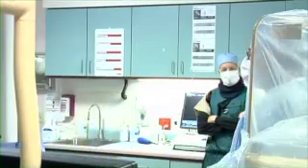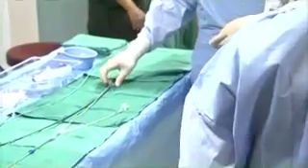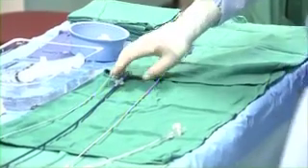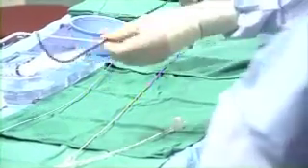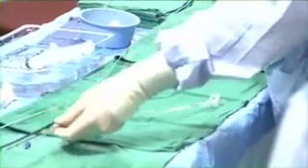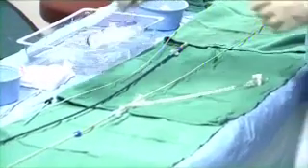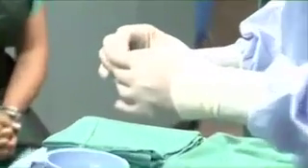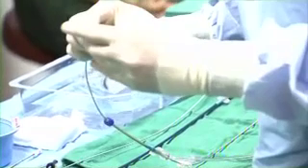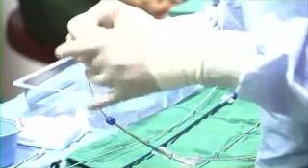Let me show you. Can you focus here for a second? Ramon, you said about 10 millimeters. How many inches is that for our viewers that don't understand millimeters? Half inch. So this is a catheter that we call the delivery sheath. Our device is going to go through this catheter, and we're going to mount it. And this is the device that we're going to use. It's called the cribriform device. Dr. Roberts will show you in a minute how this works in the cartoons. And we attach this umbrella type of device to the catheter that is actually going to deliver it. And we mount it. I tend to drop this thing, but I did it right this time. So the device is mounted.